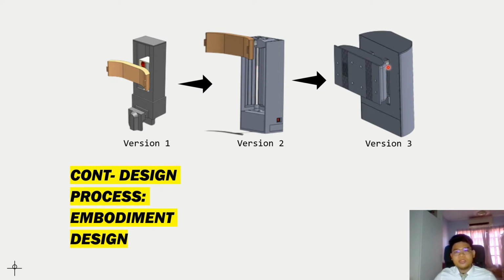So when the lead screw is mounted in the middle, like in version 3 and 4, I actually have 4 versions. The 4th version is the final version. So it is about the way the weight is distributed. Versions 1 and 2 are not exactly 50-50 distribution, right and left, compared to version 3. Version 3 is quite stable. The weight distribution is around 50-50, but it is stable. It does not topple side by side.